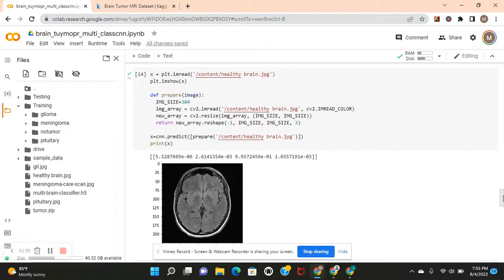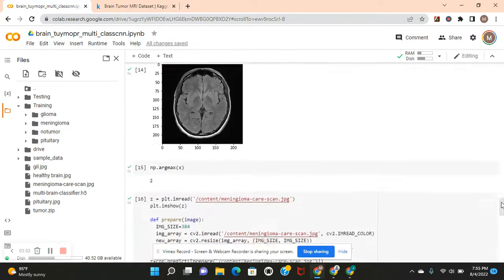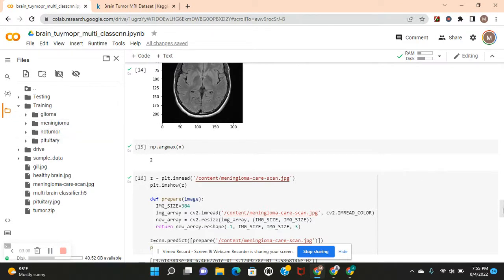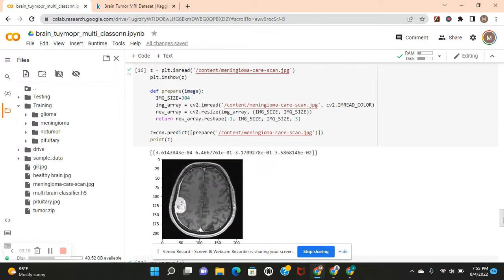Now we're going to do healthy brain, which is three, no tumor. Same thing. And zero, one, and two. You see? Class label two. Correct.